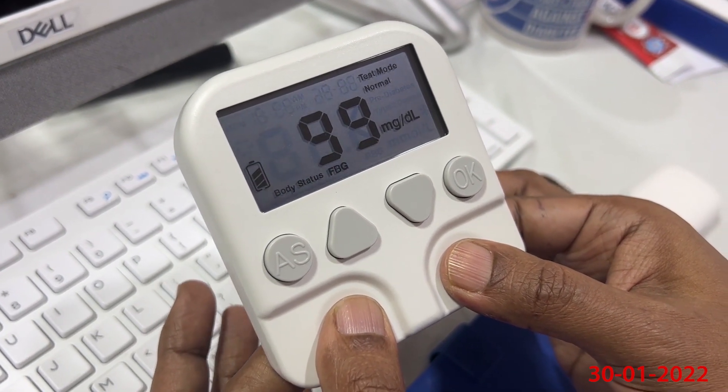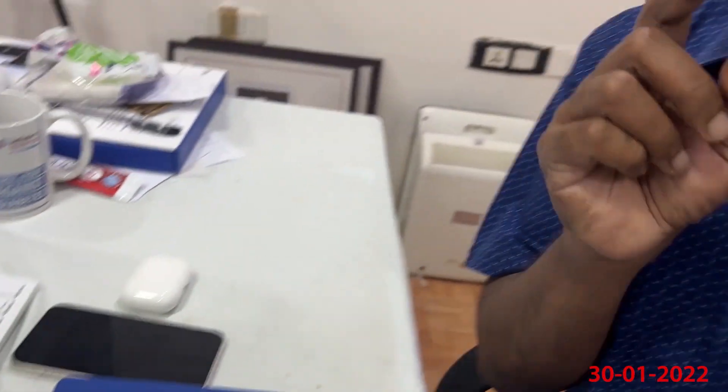The reading is 99 mg per deciliter. We tried comparing this with a glucose meter, and there is only a difference of around 20 mg per deciliter, sometimes 30 mg per deciliter. It appears to be fairly accurate.